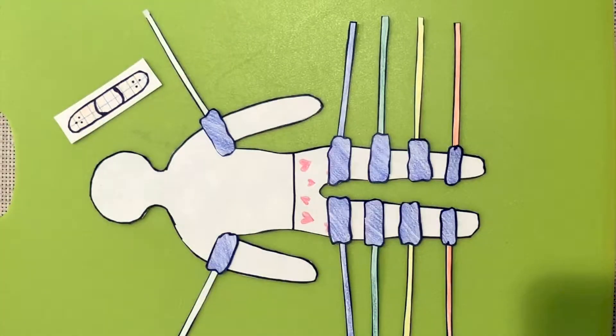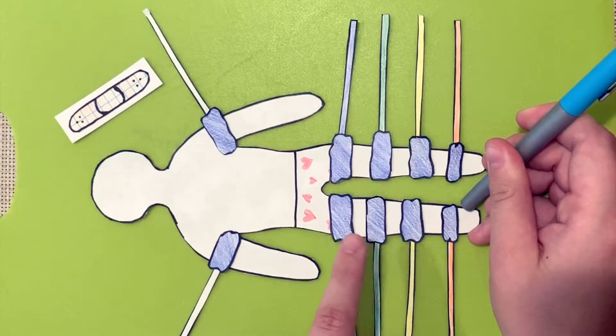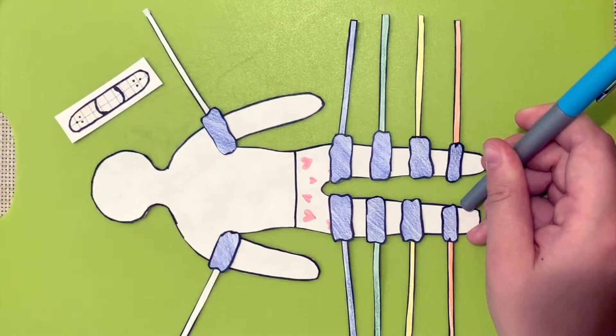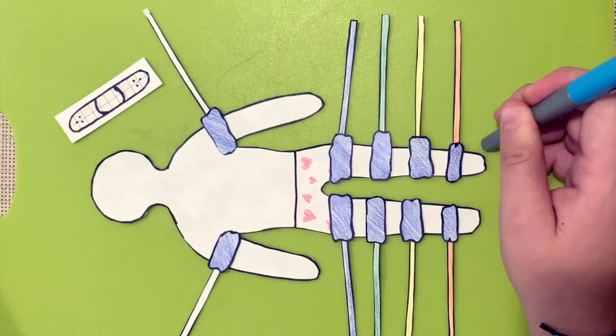For the next three pressures, you will keep the probe on the posterior tibial artery and then move up to the calf pressure, low thigh pressure, and high thigh pressure. Before continuing to the thigh cuffs, make sure you let the patient know that these cuffs squeeze very tightly and it can be uncomfortable. Then you will repeat for the left leg.